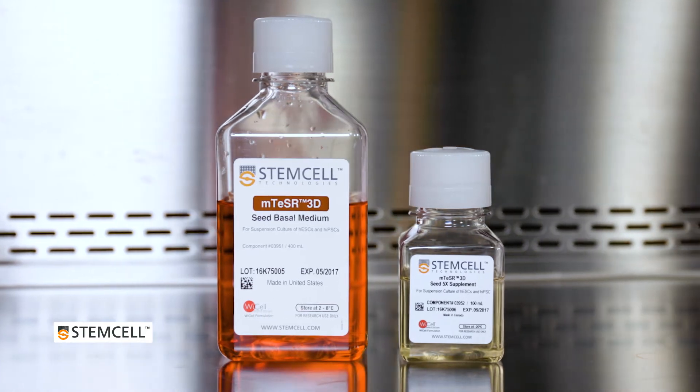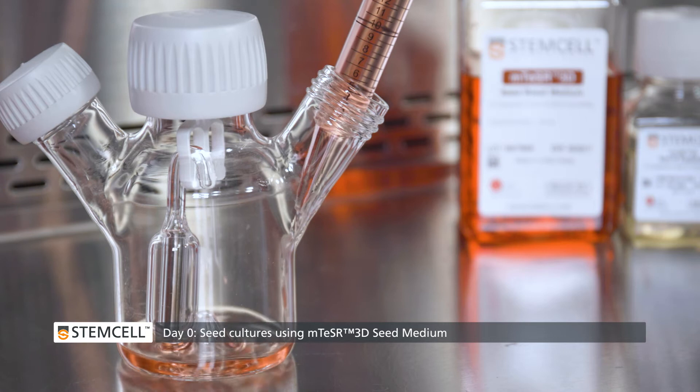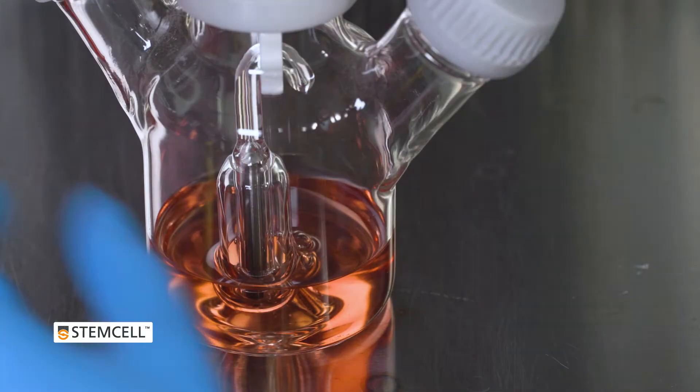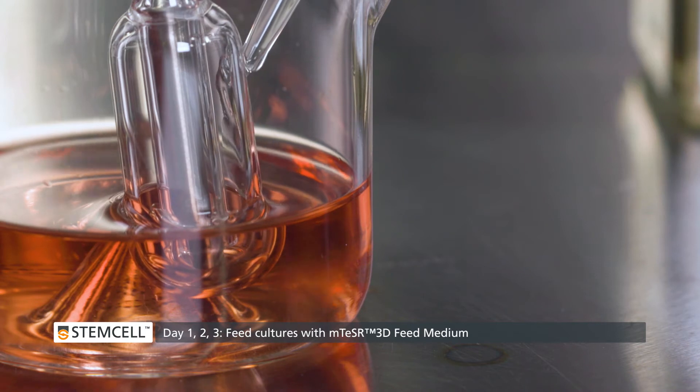The M-Teaser 3D Kit contains a seed medium for initiating suspension cultures or reseeding into a new passage, and a feed medium, which is added daily to ensure that the cultures receive all the required nutrients without the need for a medium exchange.